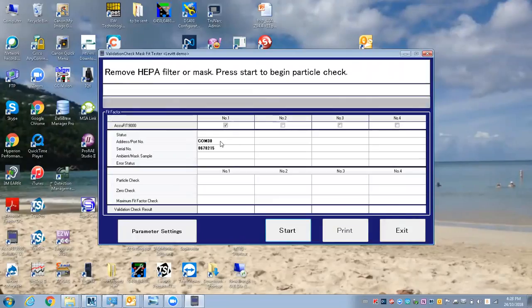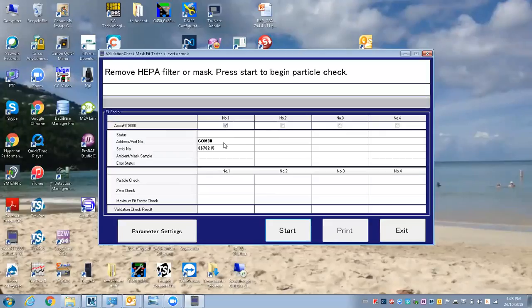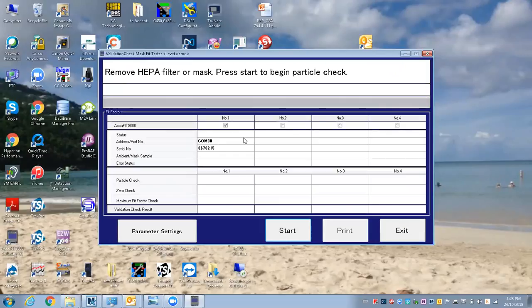I can see that it connected to the computer, no problem. Sometimes you have to go into the AccuFit to the communication section and hit connect the first time, but it seems to be connecting no problem after you do it the first time.